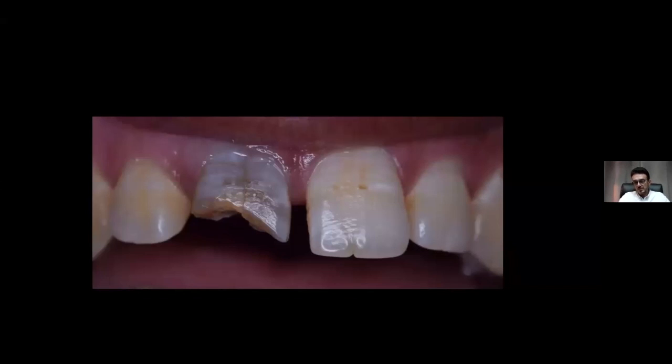So the CAD-CAM system here will not be able to fully reproduce the restoration in a natural way and mimic what we can see on the labial surface. We can use the mirror option in the software to make a mirror of this central, having a proper form and texture maybe. But in the end, the final result also comes from color and shades, which are not produced by CAD-CAM systems, whatever the CAD-CAM system is.